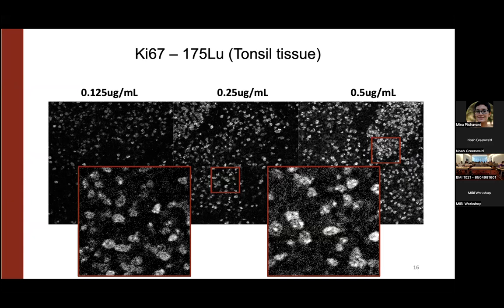What is the penetrance of antibody staining? Should one do a thicker section or multiple stacks or something like that? How deep into the tissue does it actually stain? From what I understand, because you are doing an antigen retrieval step, it should stain throughout the tissue, but I've never actually gone all the way to the bottom.